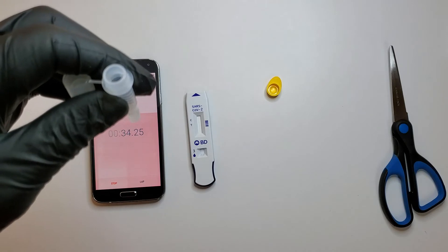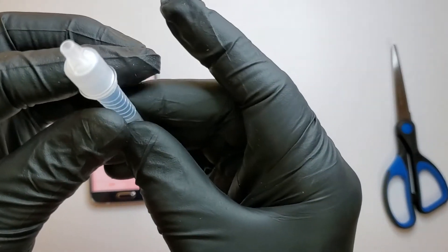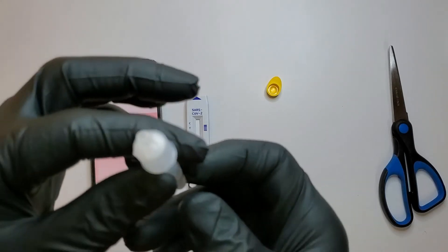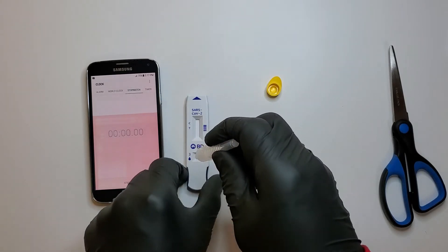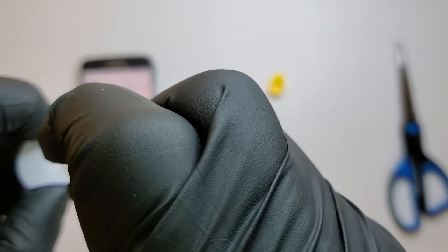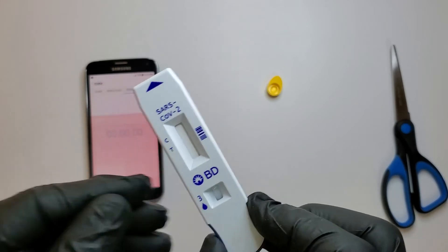We take it out, put the tube over there, and make sure it's tight. As recommended, it says to flick it. So let's do it. We leave it for 15 minutes.